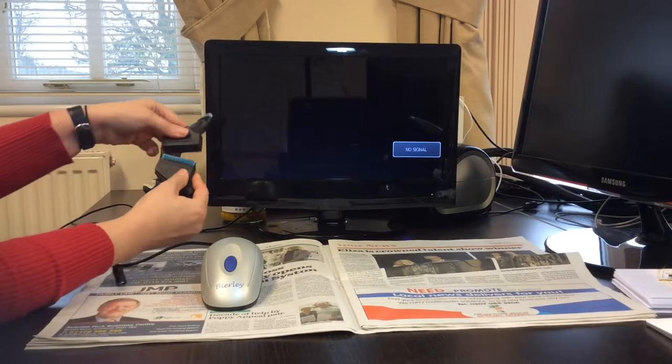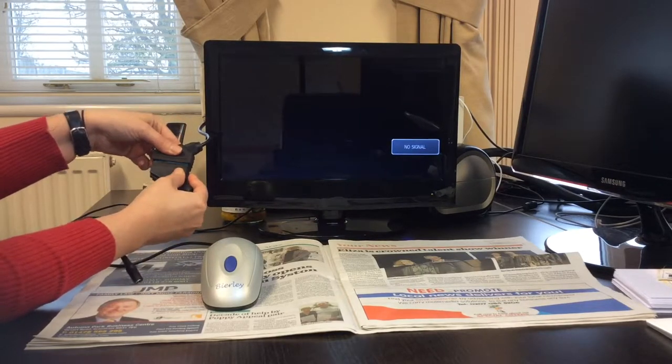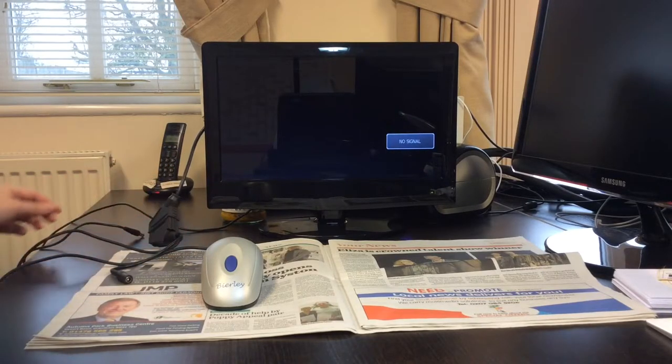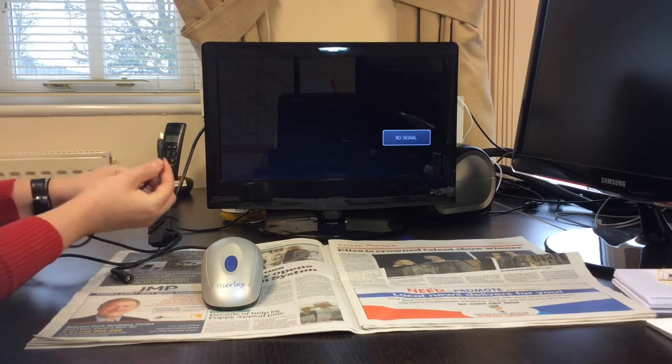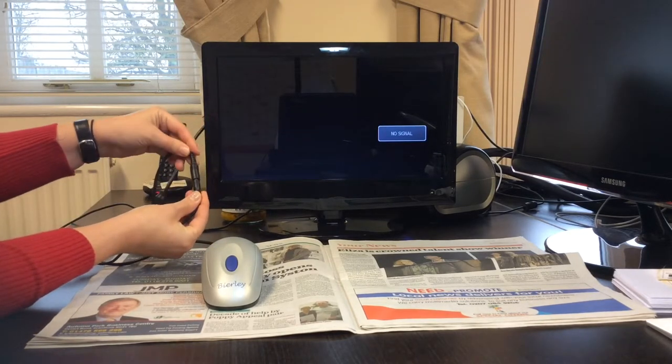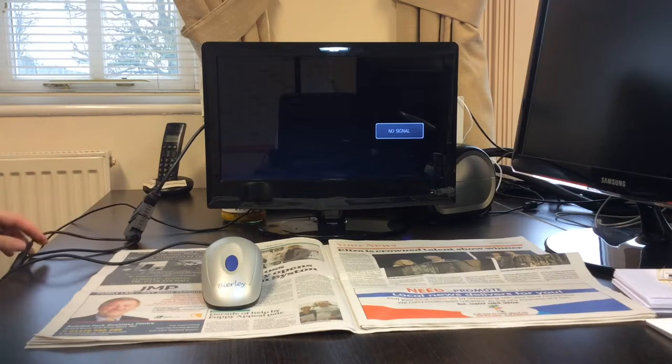Connect the mouse to your television using the SCART connection. Push together the two barrels, plug in the power supply to a wall socket and you are now ready to read.